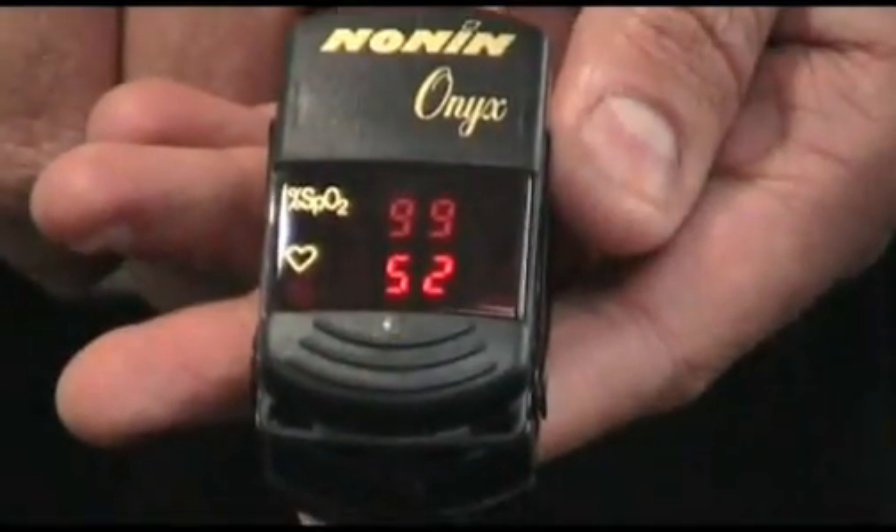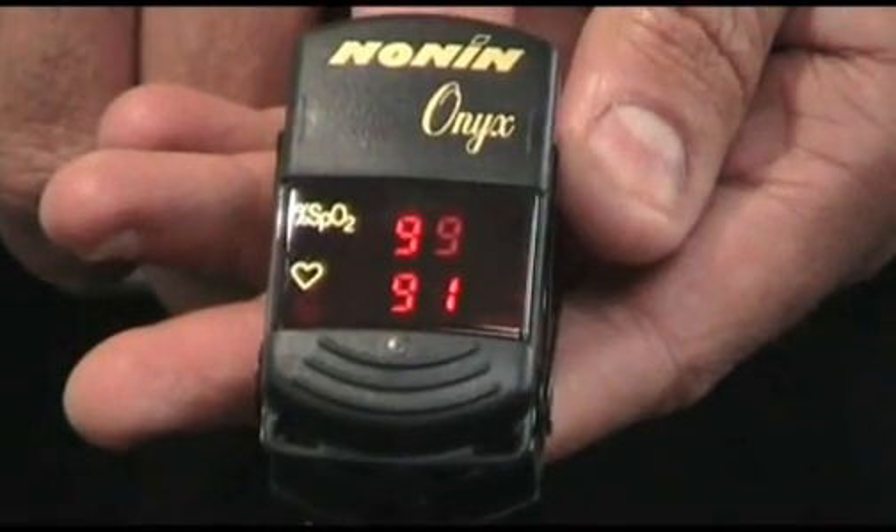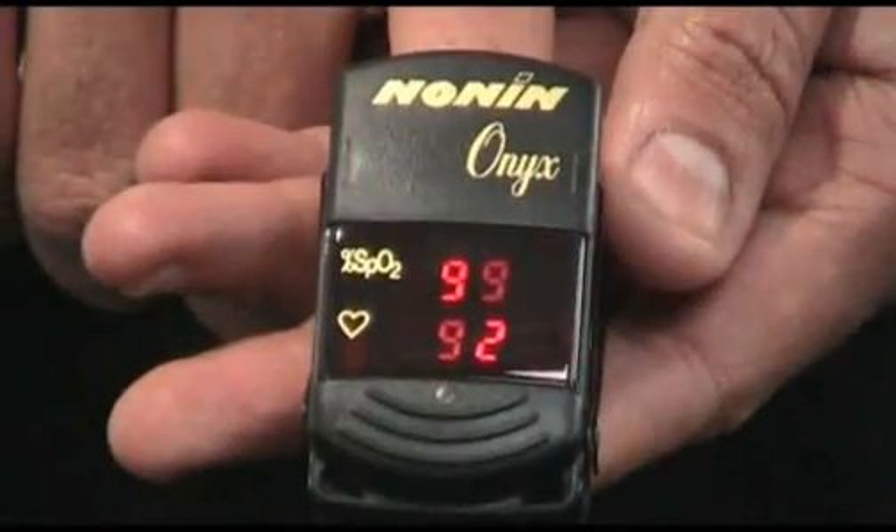There is a very clear readout display with the saturation above and the heart rate below. The LED readout can be viewed from any angle, unlike some LCD readouts.